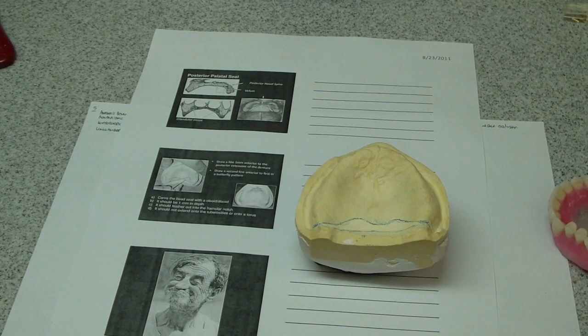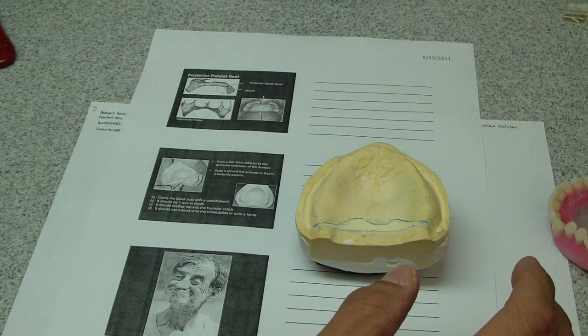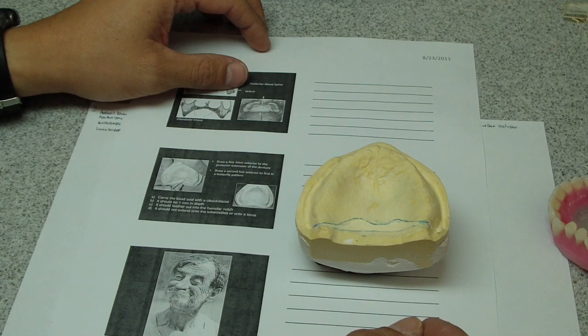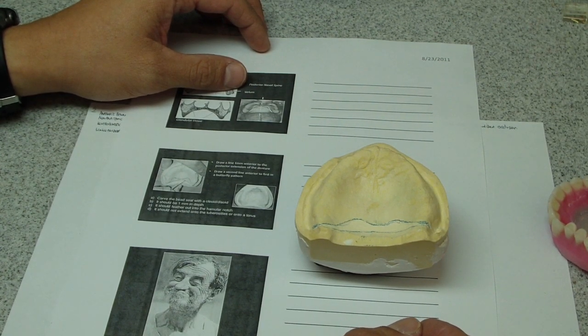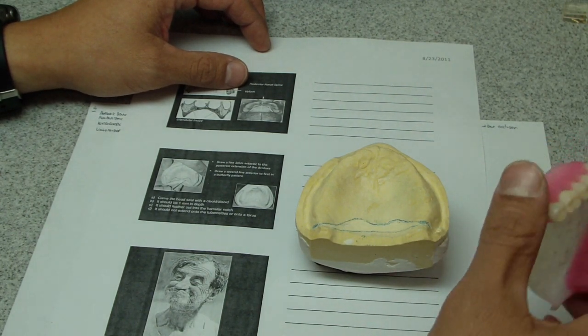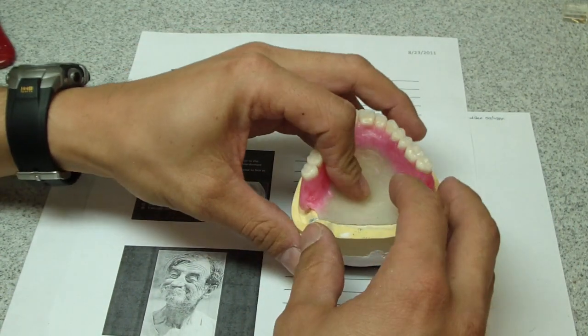I'm just about to seal up this denture for processing, and I wanted to go over some of the final touches that we're going to be doing. I'm using a lingualized non-balanced occlusion for this denture, and I've just finished placing my posterior palatal seal. Now the posterior palatal seal is designed to compensate for shrinkage of the denture base.